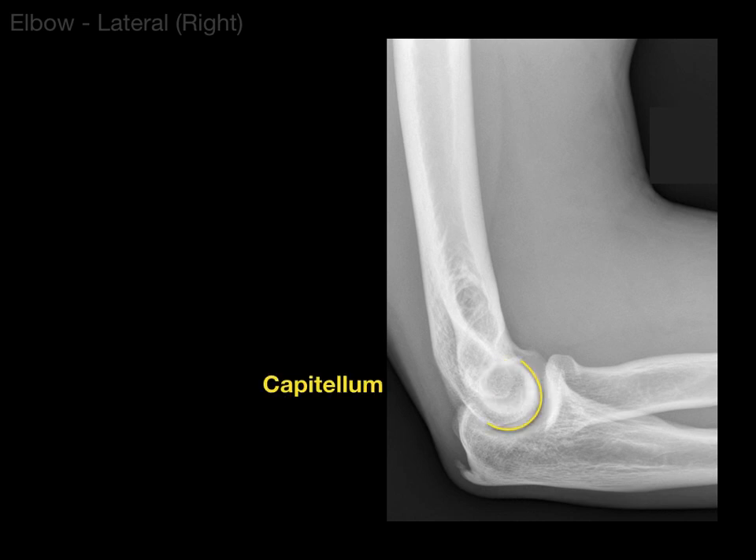That structure there is the capitulum of the distal humerus, which articulates with the head of the radius. If that's the head of the radius, that makes the next part the neck of the radius. And then on to the ulna — that is the olecranon process, which is what you rest your elbows on. Then there is the coronoid process, which looks like the beak of a crow. You have a coronoid process in the ulna and a coracoid process in the scapula. Between the two of the ulna, you've got the trochlear notch of the ulna, which articulates with the trochlea of the humerus, giving us the hinge joint for flexion and extension.